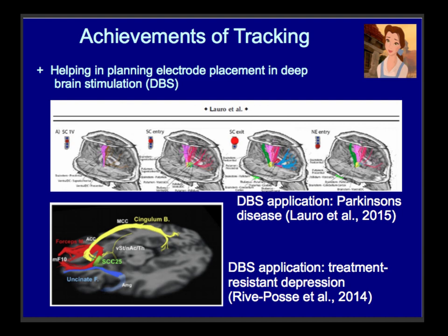electrodes in the brain. So the alternative is just to get a nice structural image and say, well, I think this bumpy structure ends here. Let me jab this metal fork into your brain here and hope for the best. I don't know if anyone is working on a deep brain stimulation project, but they do just stick a metal thing into your brain, and it usually has 4 different electrodes that you can vary the voltage on. And they stick in a lot at a time because they don't want to keep moving it around. So they put it in where they think, and they turn things on and off and crank the voltages up and down.